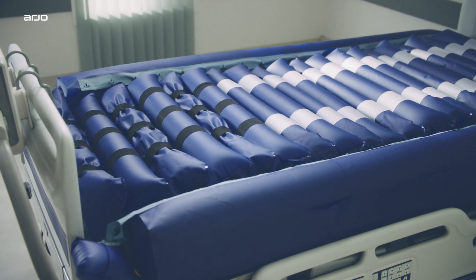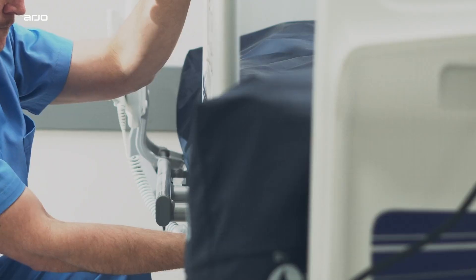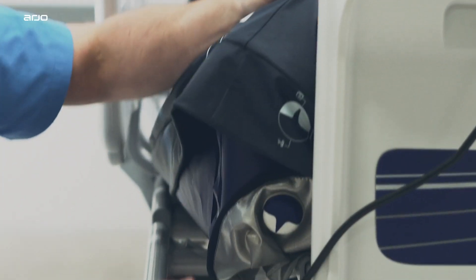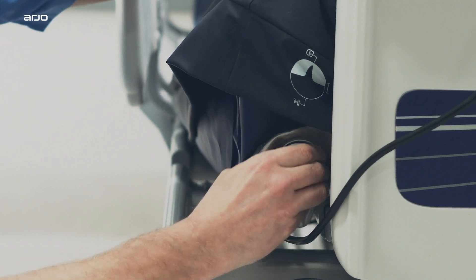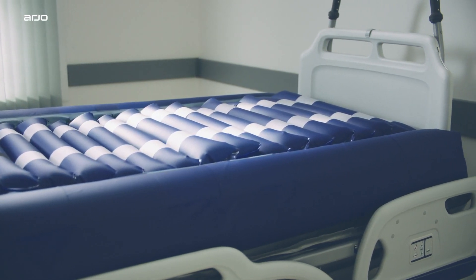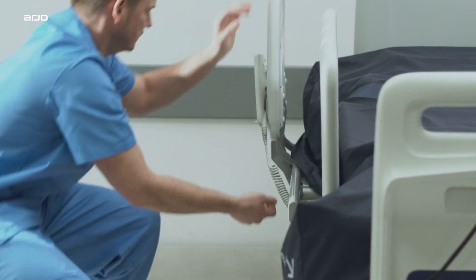Oralis Plus is designed for the Arjo Citadel Plus bed frame, a purpose-built bariatric bed with variable bed width expansion to comfortably accommodate different-sized patients and power drive, helping to reduce effort and risk of injury during bed and patient transport. This unique combination of bariatric care solutions simplifies patient transfers while delivering uninterrupted and intelligent dual therapy pressure injury management.